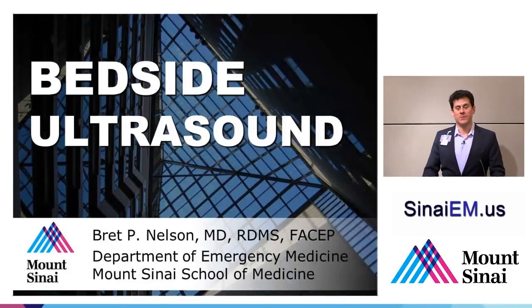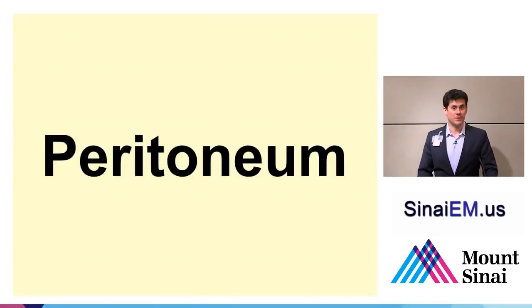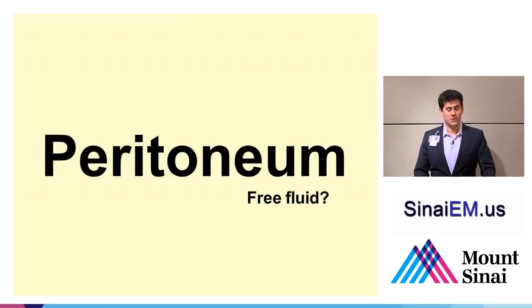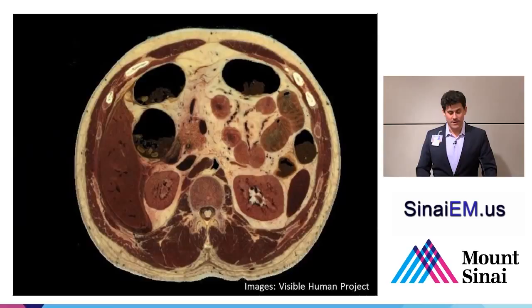So I am Brett Nelson from the Department of Emergency Medicine at Mount Sinai School of Medicine, and today we're going to be talking about ultrasound, specifically of the peritoneum. Two major questions to think about when we're focused on ultrasound of the peritoneum: is there free fluid in the abdomen? And we'll get to the other questions as we move along.